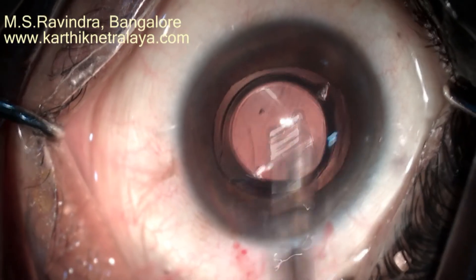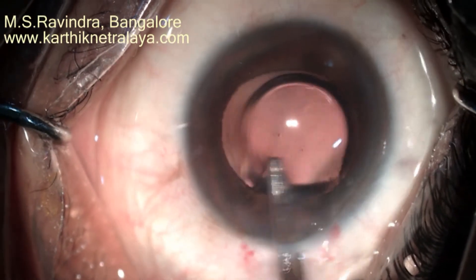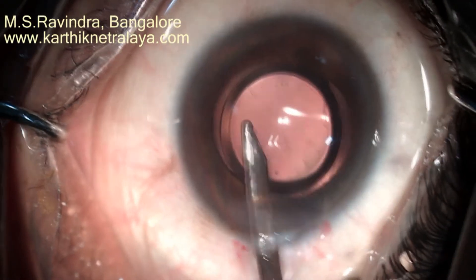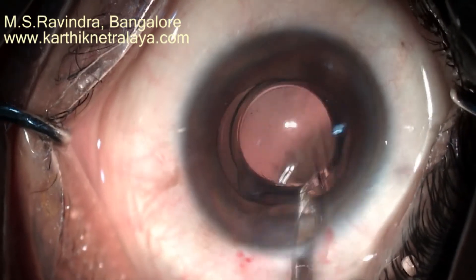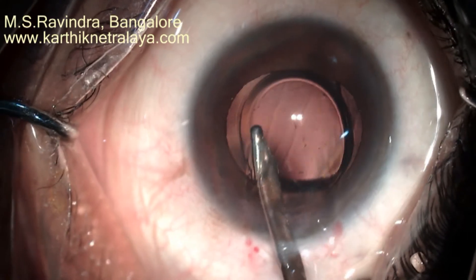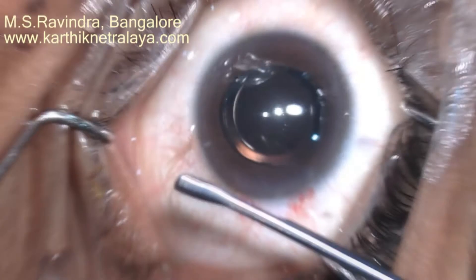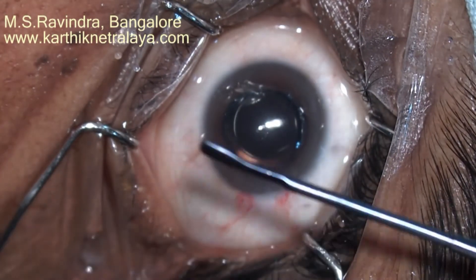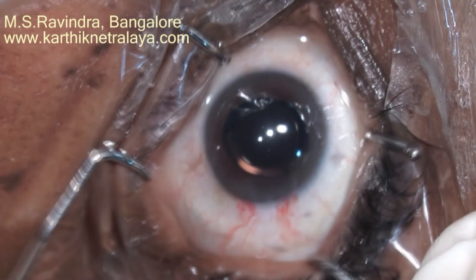There is no need to hydrate the tunnel as it is not stretched at any point. This tunnel gives a maximum astigmatism of half a diopter postoperatively; SIA is less than half a diopter in most cases. The lens is pressed backwards so that it adheres to the capsule. This is the pusher used to insert the lens through the cartridge.